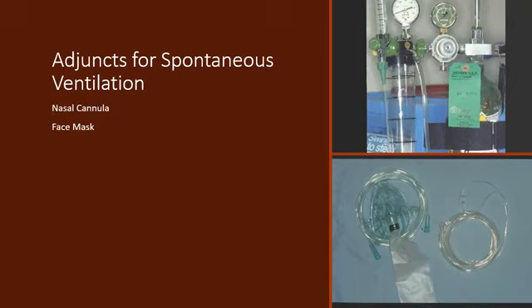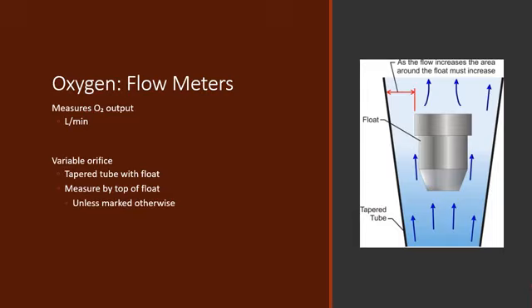And both of these, you can see, have the kinds of ends on them that will slide over top of what I call the green Christmas tree adapter. It's the conical shaped green attachment that screws onto the end of the oxygen port. You can see in the left-hand picture, at the left edge, the green Christmas tree adapter with the knob and the flow meter up above. You would simply hook the end of your face mask line onto that and turn the knob on to start the flow of oxygen.